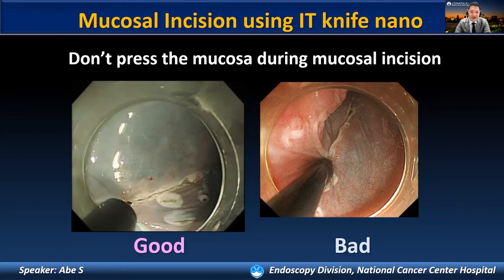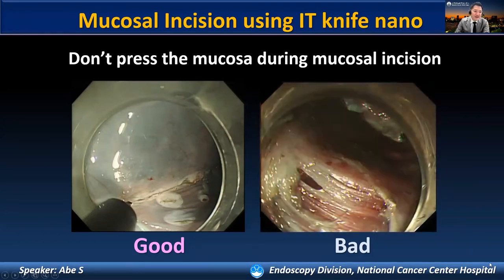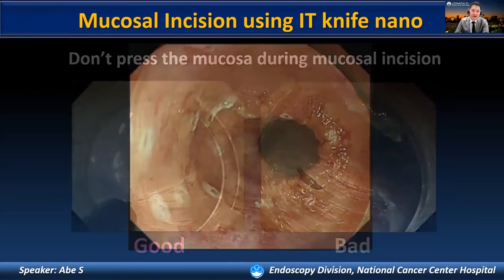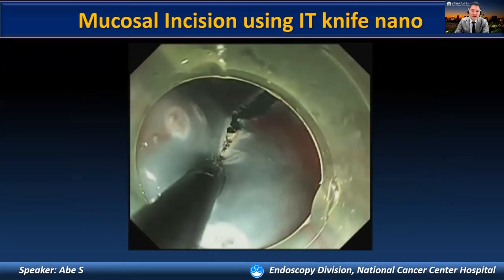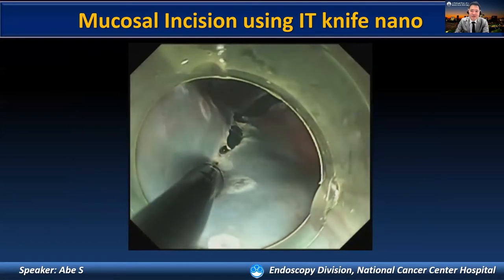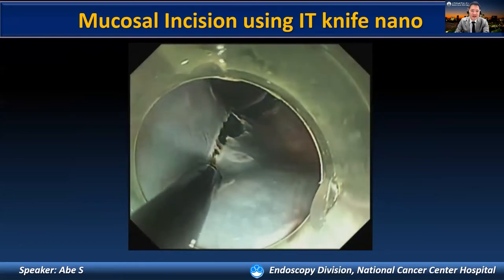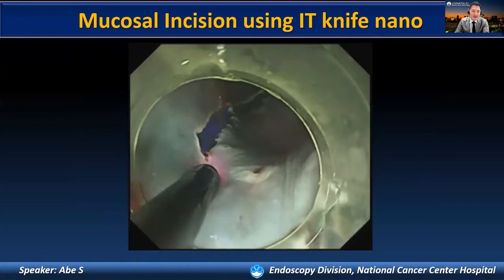When it comes to mucosal incision using the IT knife nano, it is very important not to press the mucosa too much. If you press too much, you may experience inadvertent muscle injury during mucosal incision. We can safely and efficiently perform longitudinal mucosal incision just by pulling back the device, not pressing too much.